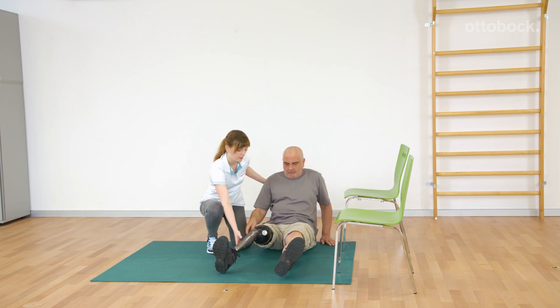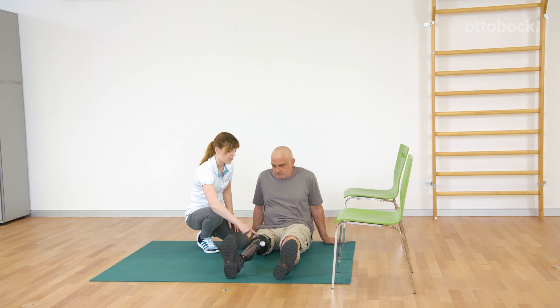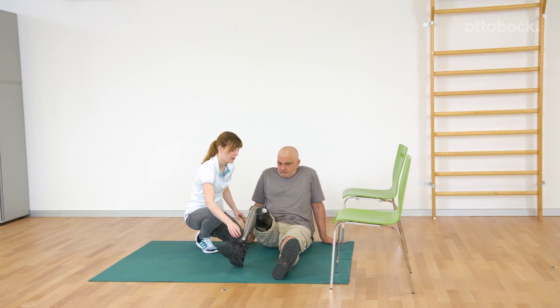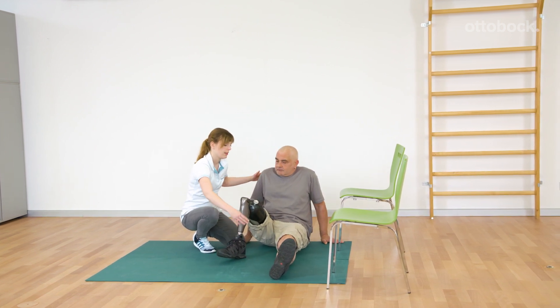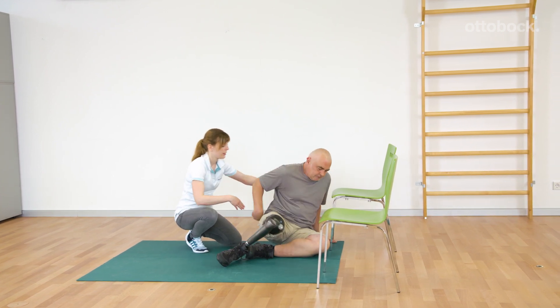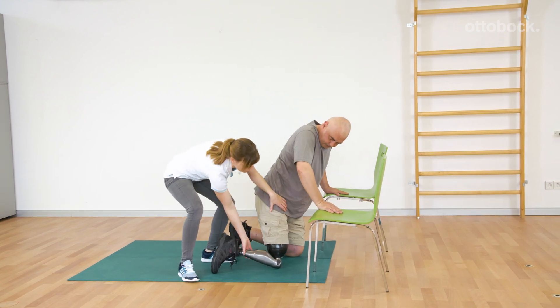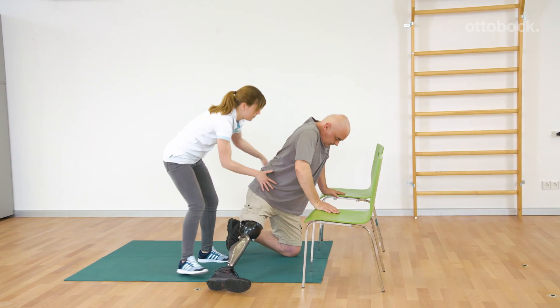If the user is sitting with straight knees, the sitting function is activated automatically. Gerhard can easily bend the knee to move to a kneeling position. Franziska supports Gerhard at the hip and helps while he is getting up. Standing up is again executed with an extended knee.